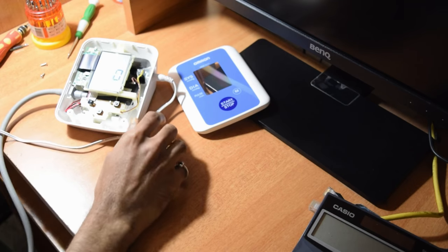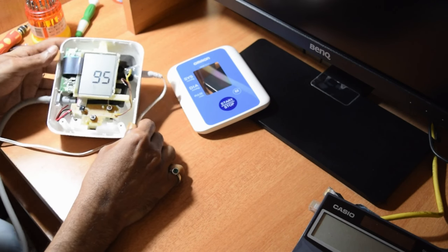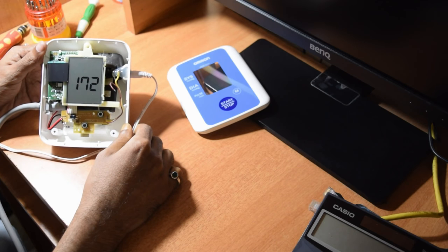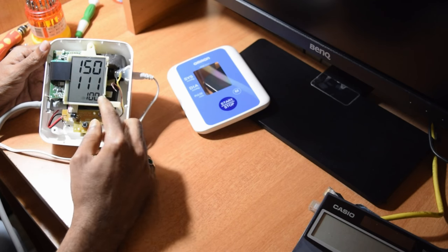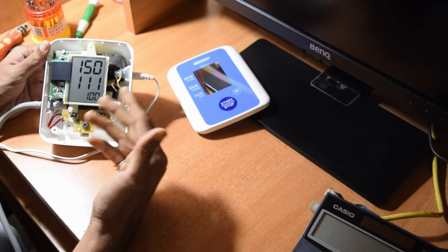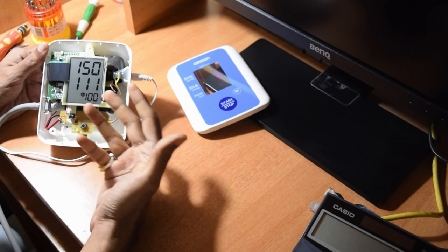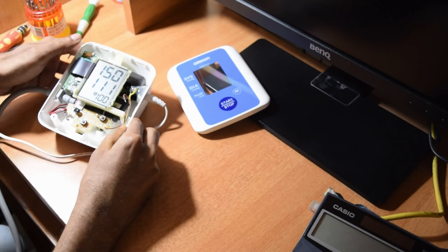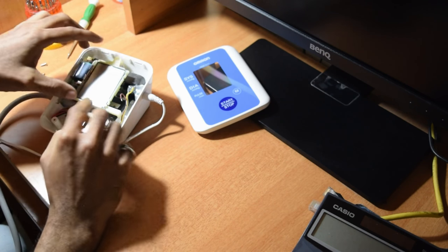So let me just sit in a relaxing position. Yeah, now it has reduced to 150. So the more I relax, it is going to reduce down. So this is what is expected out of any blood pressure monitoring device. One interesting thing, let me just stop before that.